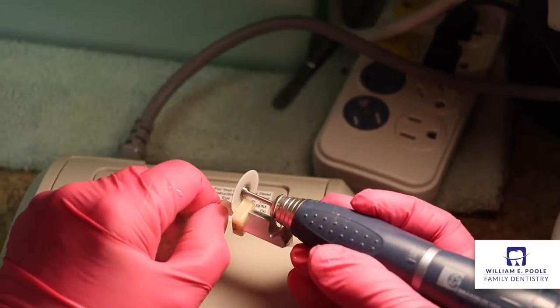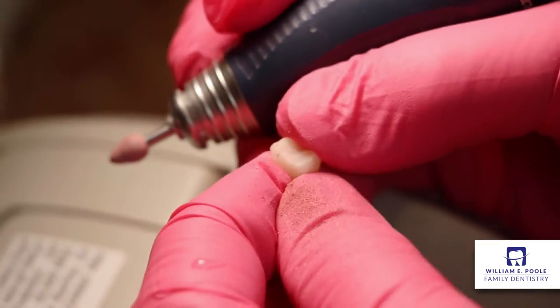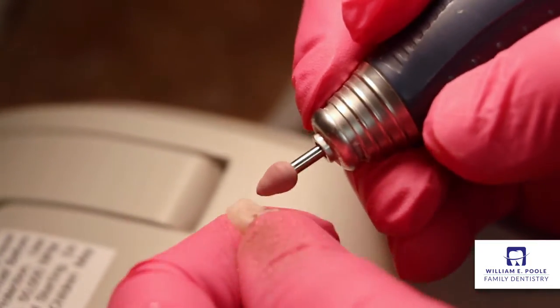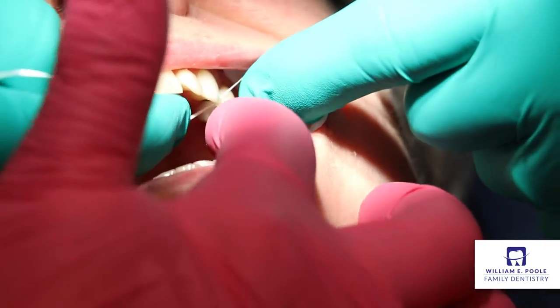We use a series of polishing points to bring out a high luster and a nice shine of the teeth, so that when they're bonded in, they look very natural.